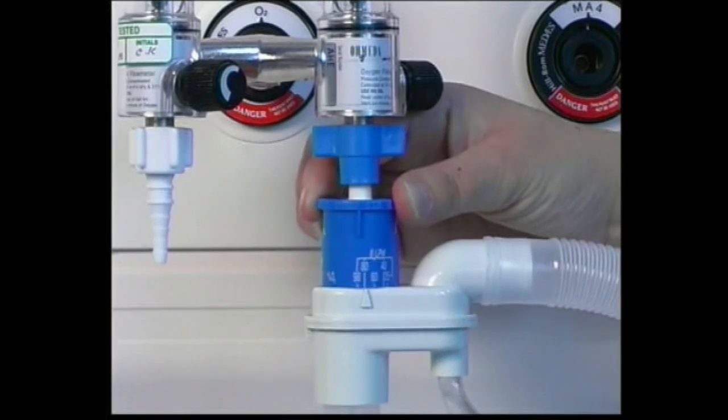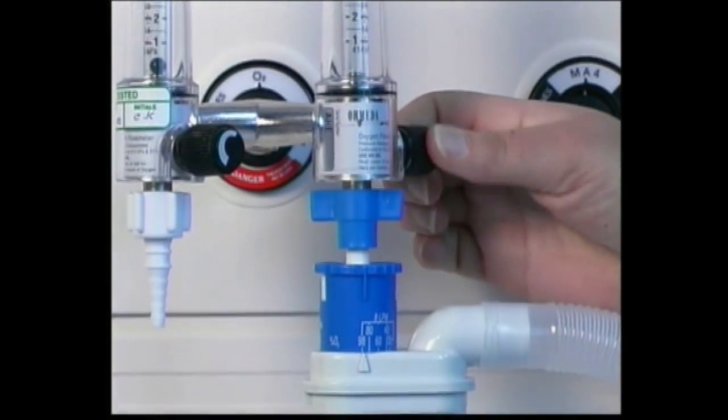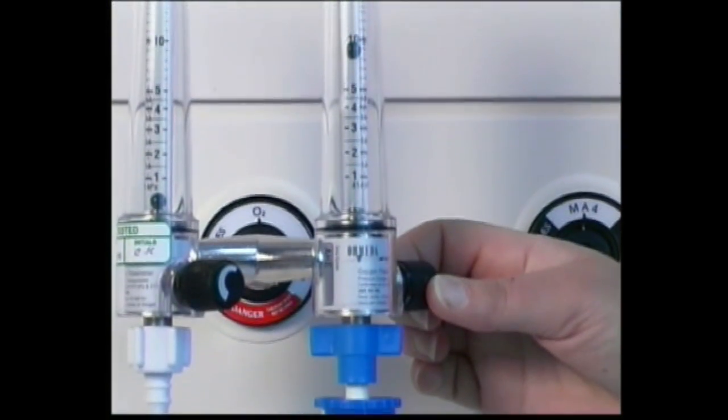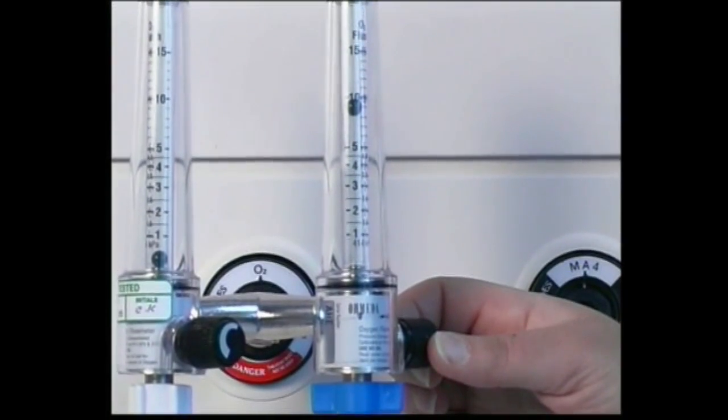All adult patients should be hyperoxygenated immediately before the procedure to reduce the risk of complications such as hypoxia and cardiac arrhythmias.